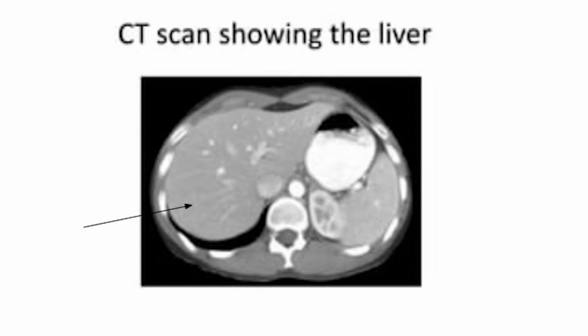I have shown in this slide a CT scan of the liver. I have also shown the CT image of the mid abdomen where you can see various parts of the abdomen. You can observe from these CT images that the CT images are clearer and can offer better images in case of soft tissues as compared to conventional X-ray images.